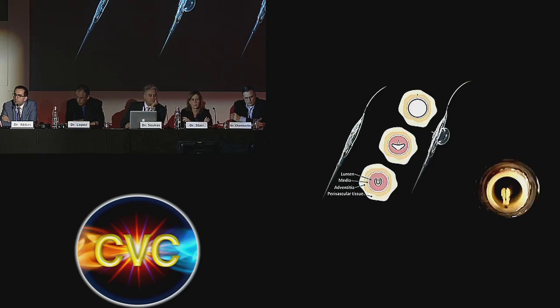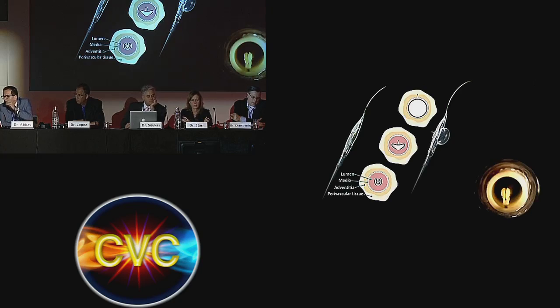So next image, and click one next also, Chris. You can see this small little video as it starts inflating, it pokes through the arterial wall, and then that blue contrast there is just a way to show what we would be injecting. And in this particular trial, in this particular study, we're doing dexamethasone.